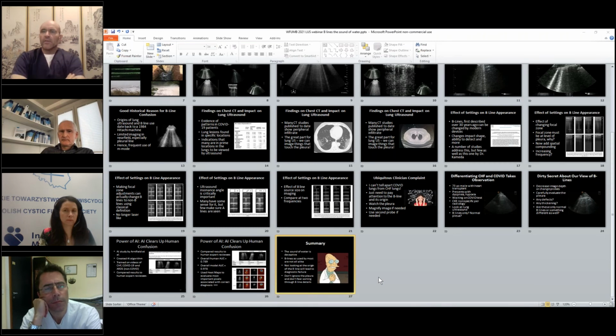I do think ultrasound of the lungs is depicted as deceptively simple. Well, actually, it's depicted as simple, and that's deceptive. I think there's so much to ultrasound that people learn over time, paying attention to the pleura, subpleural consolidation, overlap of findings between different disease processes. And I personally think that'll take probably 50 abnormal examinations or more, because the normal lung examination, as opposed to the normal gallbladder examination or the normal examination of the ovaries with endovaginal ultrasound, where anatomy is always different, you learn from every exam.